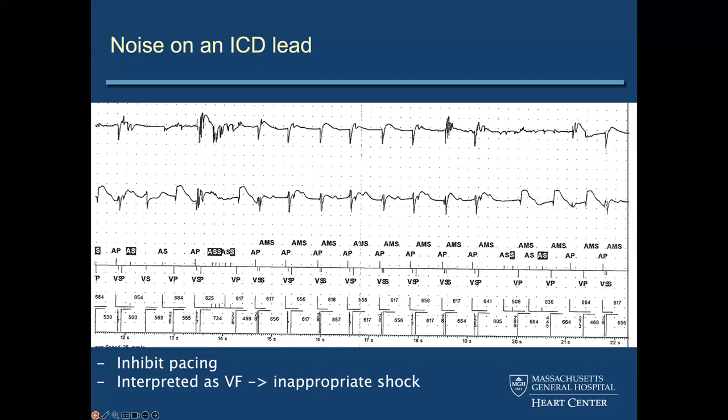So, yeah, that's exactly right. That's the more advanced interpretation here. I was choosing to focus on just the basic consequences of noise, meaning it has consequences for bradyarrhythmia pacing as well as for tachy programming. You're right to point out safety pacing, which can happen in response to noise on some of these systems. But again, depending upon where the issue is, you can't necessarily bank on that stepping in, and it depends upon the generation of the device and the manufacturer, et cetera. So thank you very much for including that. It's extremely helpful and good for everyone to know.